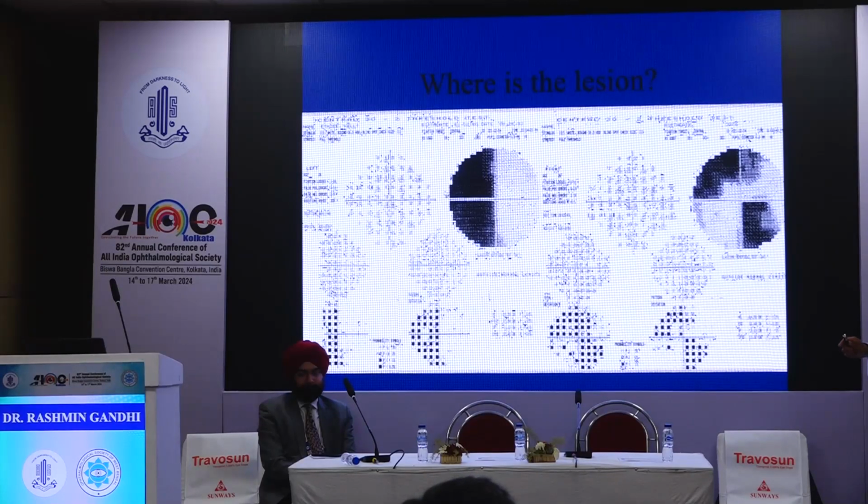We go a little further and ask, can you localize it even more, and what are we dealing with here? Again, you look at the left eye, which has been very helpful by becoming completely hemianopic. So there is a complete hemianopia of the left side. So you know that you probably are dealing with a chiasmal problem. But how does the right eye give you a clue? So here you have a lesion which is on the nasal side and a temporal side in the inferior part. So what you now know is that there is a complete temporal defect in the left side, and an inferior temporal defect of the right side.